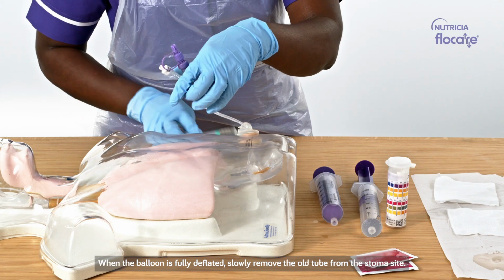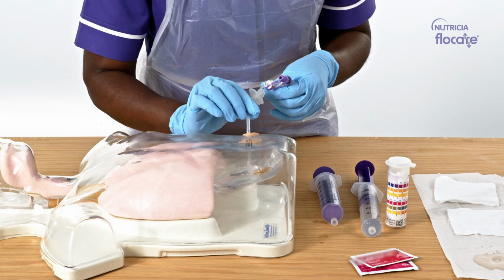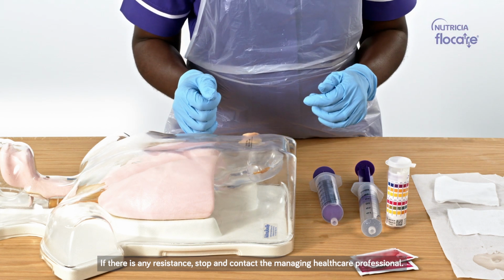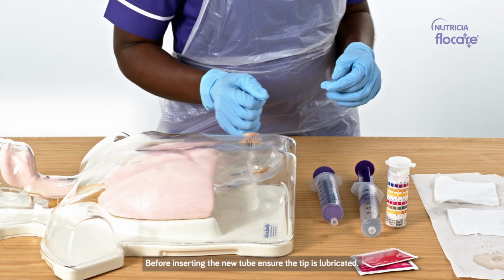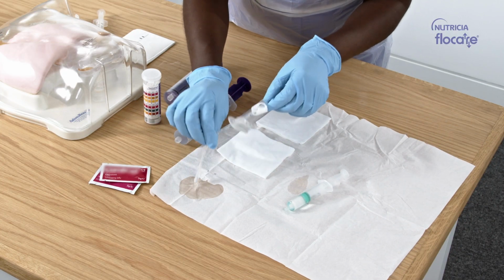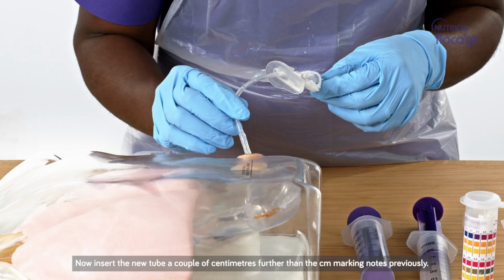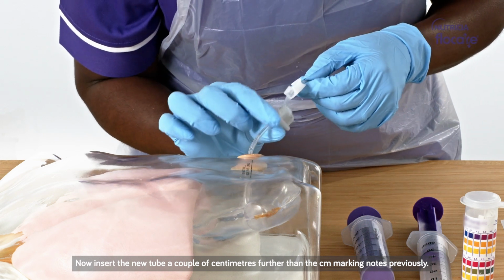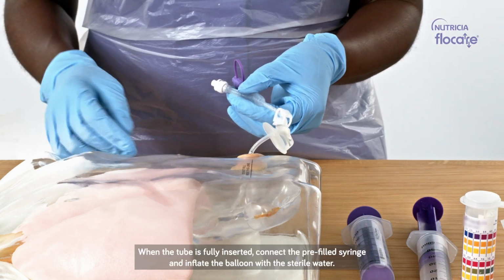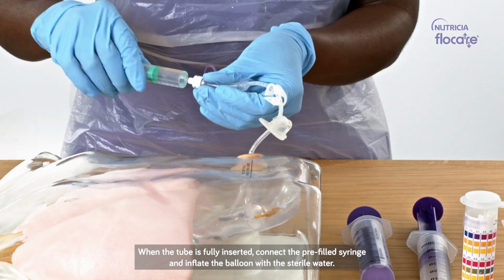When the balloon is fully deflated, slowly remove the old tube from the stoma site. If there is any resistance, stop and contact the managing healthcare professional. Before inserting the new tube, ensure the tip is lubricated. Now insert the new tube a couple of centimeters further than the centimeter marking noted previously. When the tube is fully inserted, connect the pre-filled syringe and inflate the balloon with the sterile water.